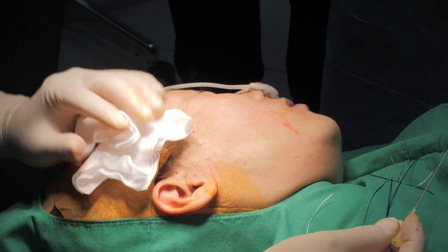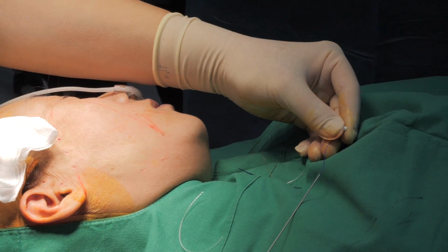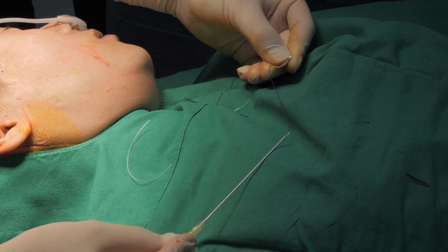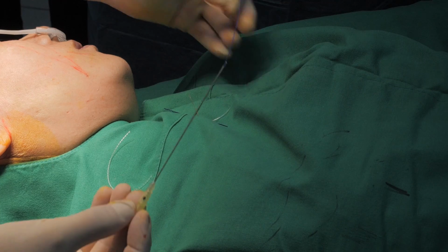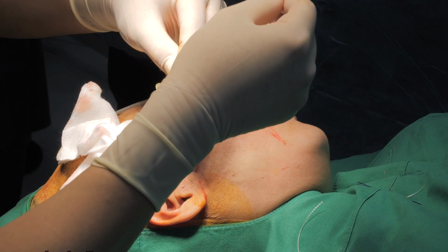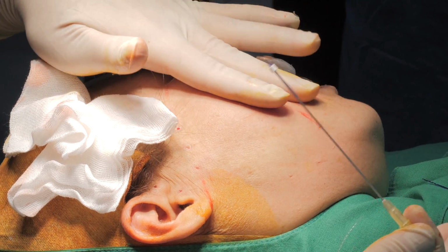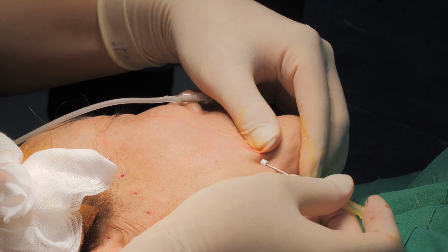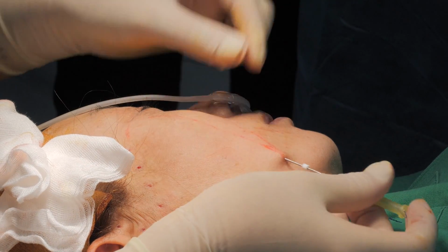What's this? Okay, I will show you. PDO. Master Cog, master Cog here. It's a Visu 1, right? Because it's loaded on an L-type cannula, but it's thinner. So 19 gauge. The previous one was 18 gauge. For the medial face, we should choose a thinner one. The layer on the medial face is not clear. It's mixed. So you should be careful.